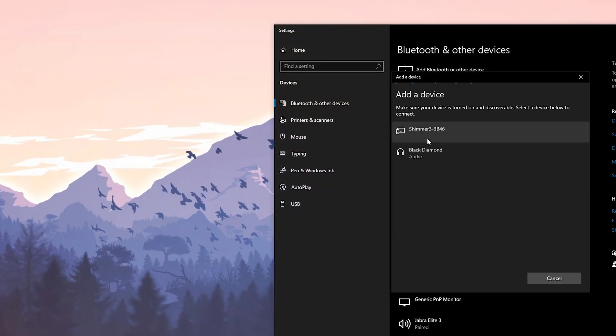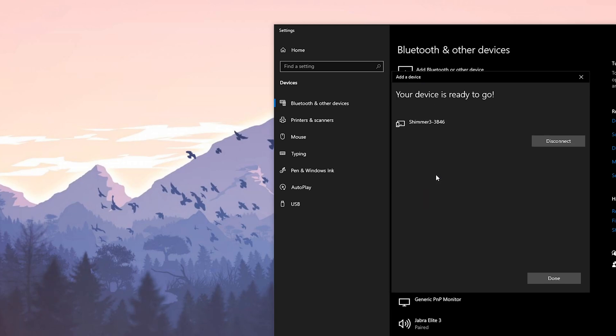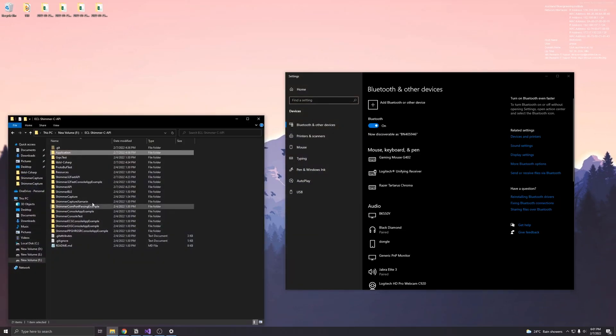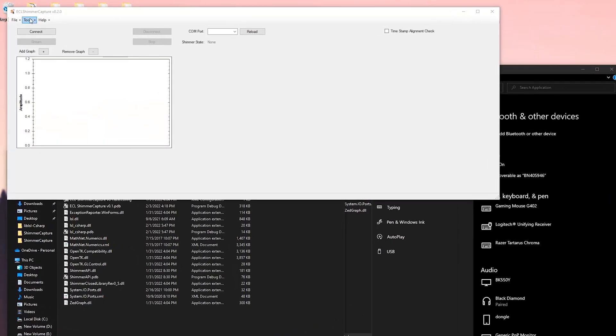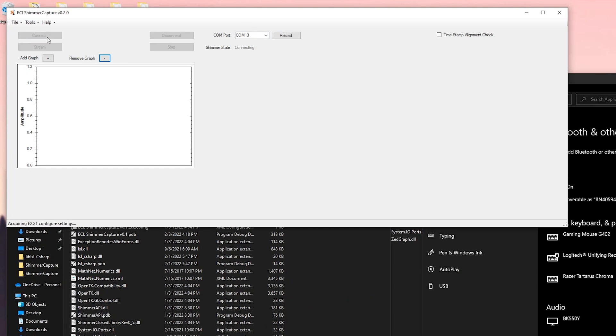The default pair code is 1234. Once connected, start the application. In the application, find the COM port - in my case it's 13 - click connect, and then it will stream.